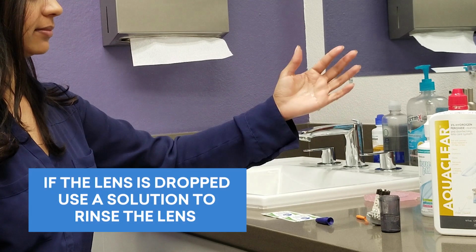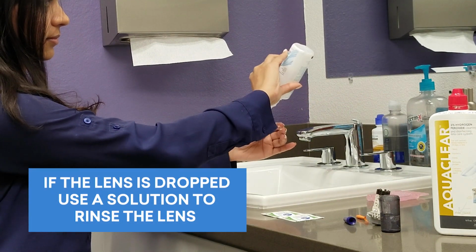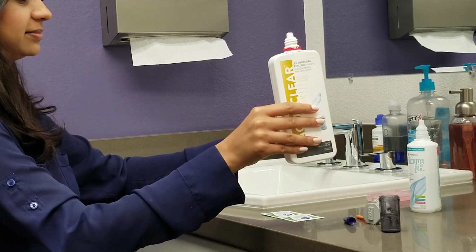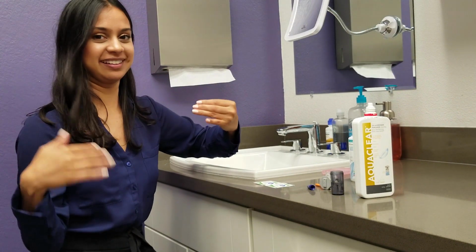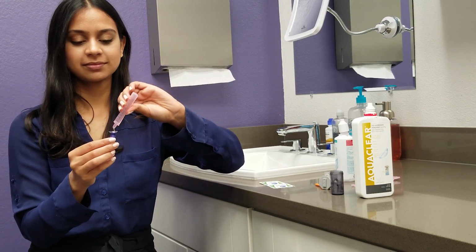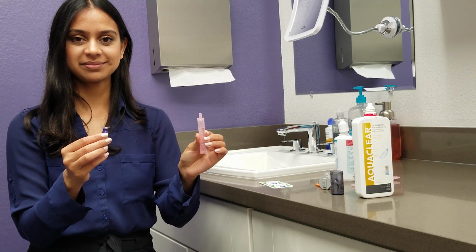If the lens falls on the table or ground, use the multi-purpose solution to rinse off the lens. Do not use the hydrogen peroxide solution. Never put the hydrogen peroxide solution into your eye. Do not use anything besides preservative-free saline to fill the lens before inserting into the eye.